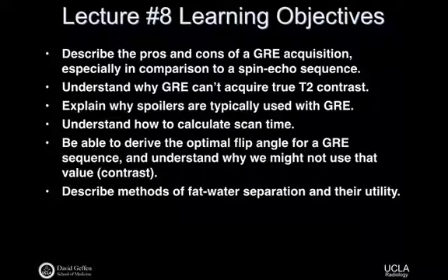It's chemically shifted, it's shielded. The electron shielding is such that fat resonates at a slightly different frequency. And so now you have slightly different frequencies between fat and water. And if they're different in frequency for some finite period of time, then their transverse magnetization components can be out of phase. So this is the concept that he was alluding to. And if you have fat and water out of phase, in fact, you can have many echo times and get many phase differences between the magnetization. You can start to calculate fat images and water images.